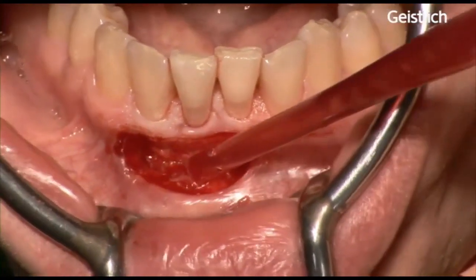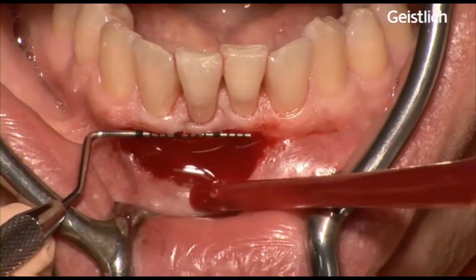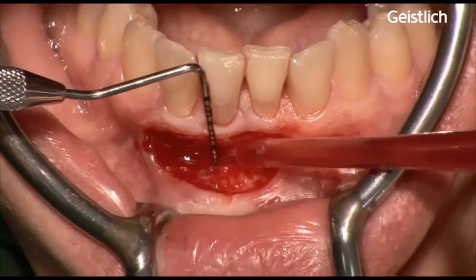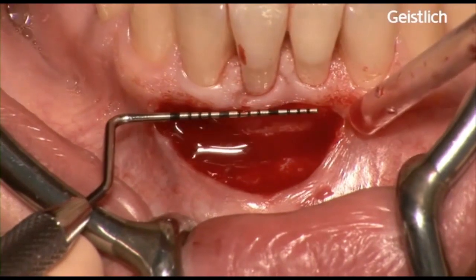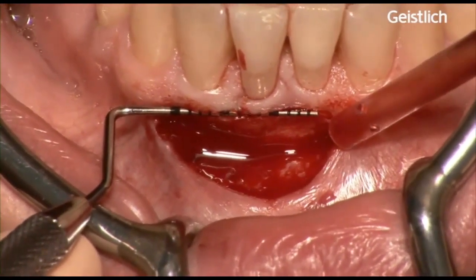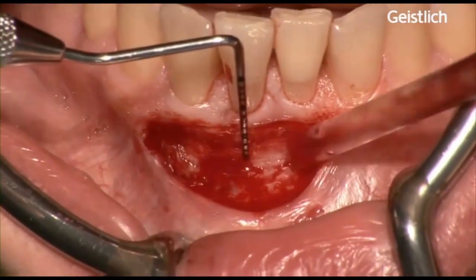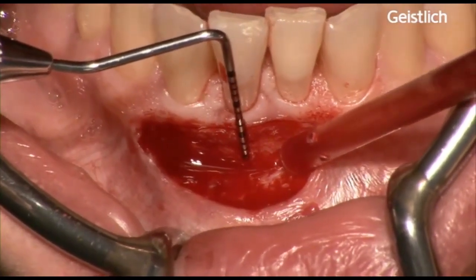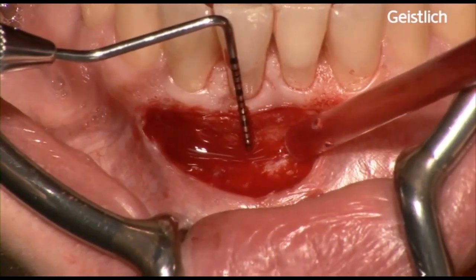After final preparation of the flap, measurements of the recipient bed are taken with a periodontal probe. In this case, we need a graft or matrix size of 15 mm long and 7 mm for the depth of the vestibule. Precise trimming of mucograft is important to avoid tension when suturing the device.